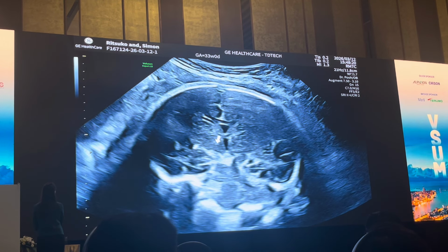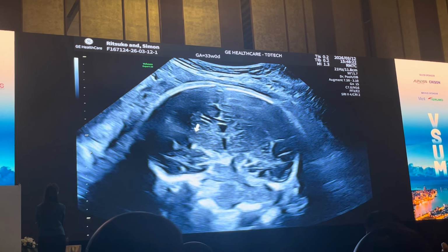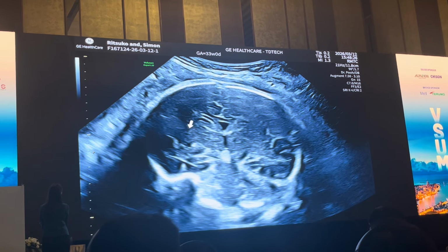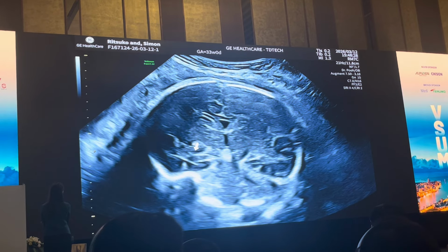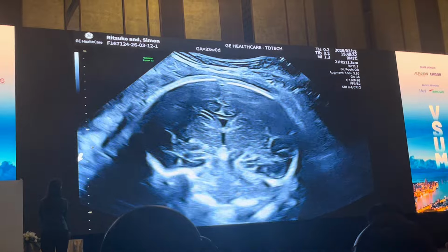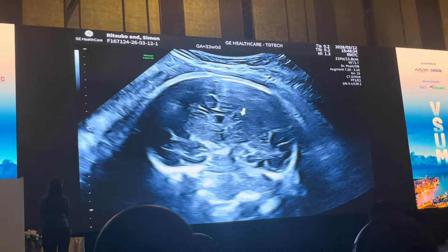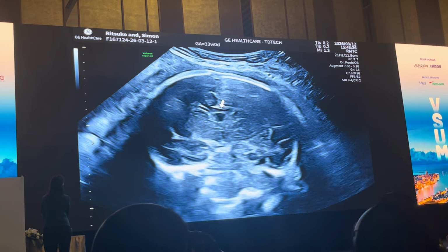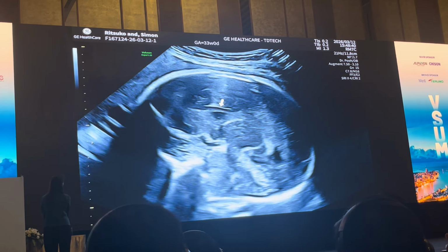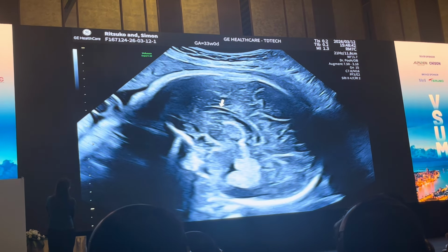And I can see the thalamus on the opposite side, and here is the head of the caudate nucleus. Over here is the anterior limb of the internal capsule passing posteriorly, and then here we have the sylvian fissure. Once I've got the genu of the corpus callosum, I hold that into position, and then I rotate, keeping that line of the corpus callosum into view, and I rotate on that.